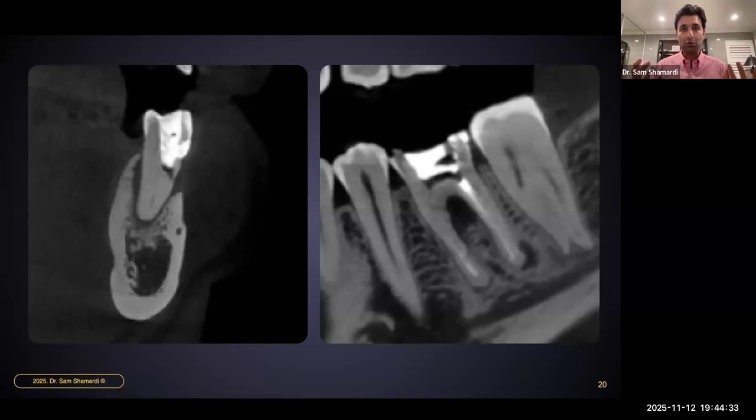And we think, okay, well, we're just going to be doing a bone graft. We might not be doing any membrane work. Of course, you remove the tooth, you end up seeing that the infection and the bone defect is significantly bigger than what you had anticipated, and you may not have the material. And even if you do, you now have that uncomfortable situation where you have to have a conversation with your patient as to why you're charging them for additional material that they didn't have in the first place. So, all these things can be avoided by having that radiographic data on the front end.